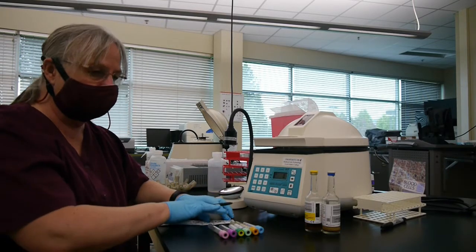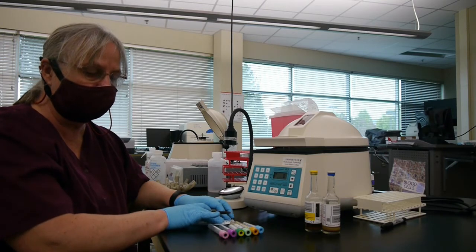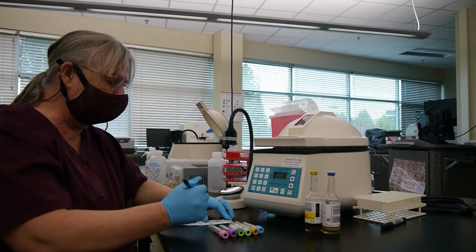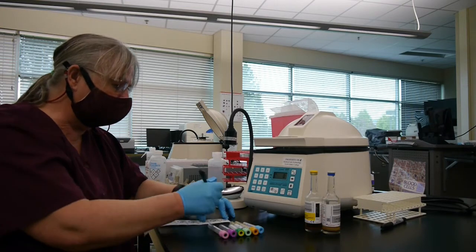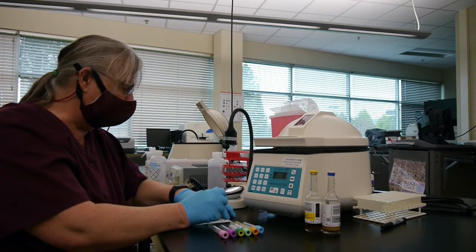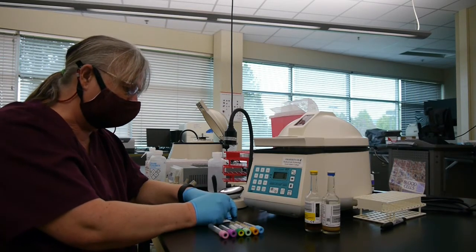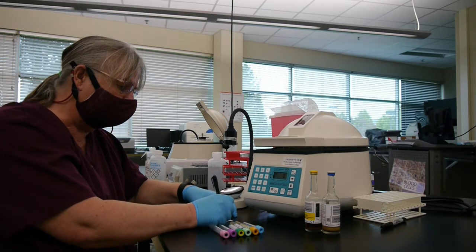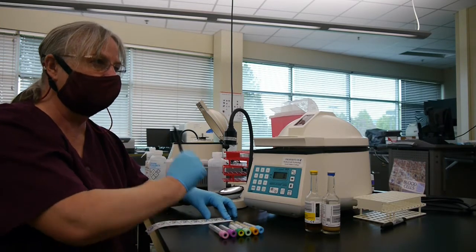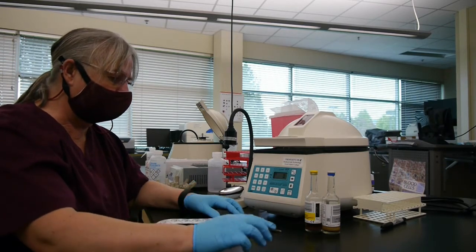You're always going to have printed labels that help with patient identification. All you have to do is put the date and time — the date is often already on there — and then put the time and take responsibility: be bold and proud, put your initials or your employee number down on there.